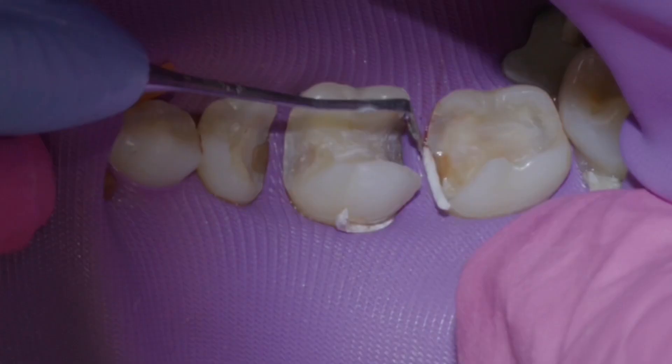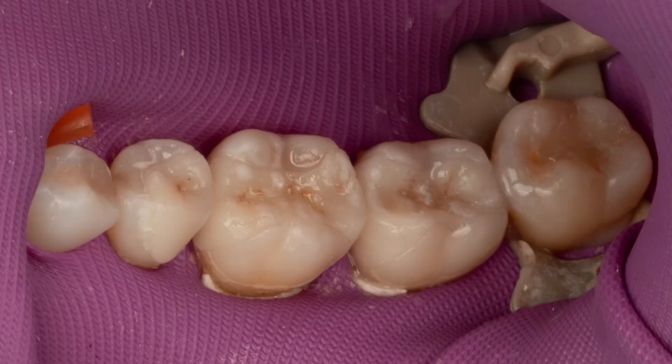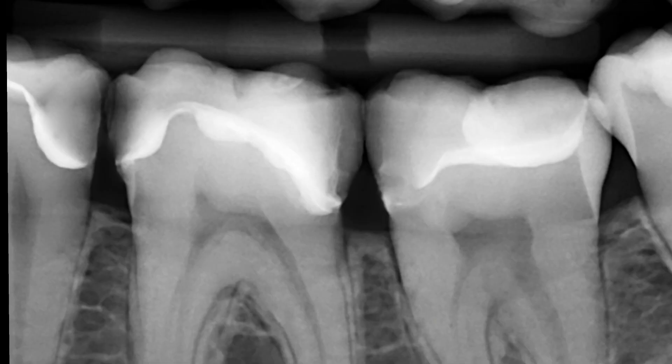I'm using selective etch technique with a universal adhesive from Ivoclar, and a light-cure-only cement called Vari-link Aesthetic LC. We have amazing results — much better than my direct resins would be, and more predictable in my hands.